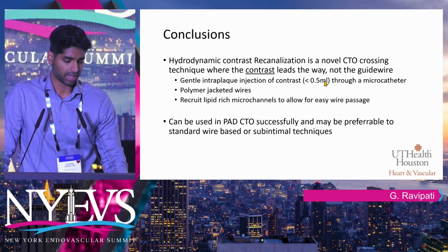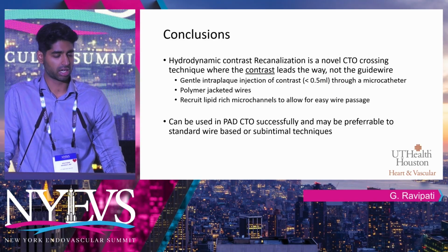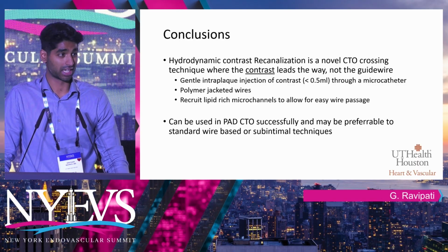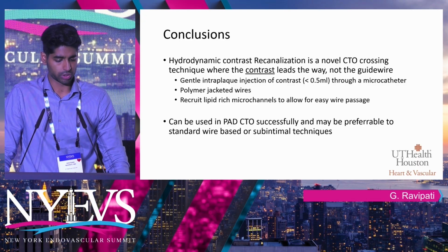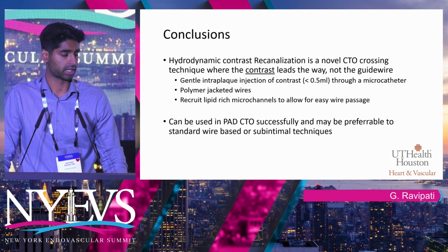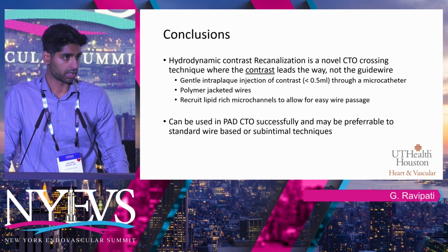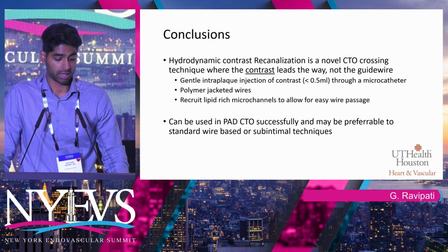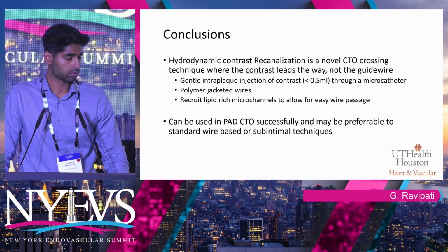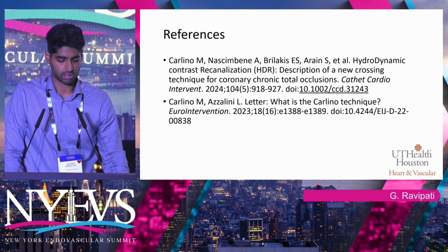So conclusions: HDR is not just a crossing technique, but almost a change in philosophy where instead of using the guide wire to lead through the body of a CTO, we're using contrast. And again, I've shown you how it worked. We're using it a lot in the coronary sphere with a lot of our CTO PCIs. But honestly, it can be used in any CTO and may be preferable in some instances in more complex lesions, with long-term studies ongoing. These are my references.